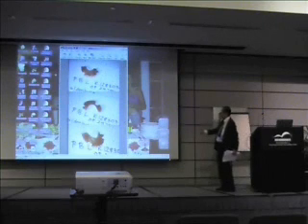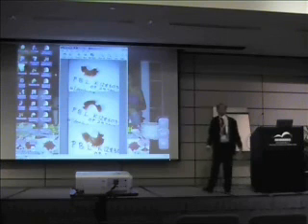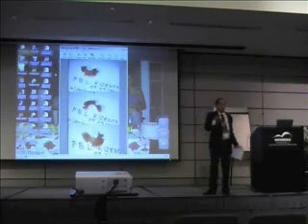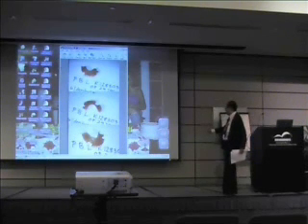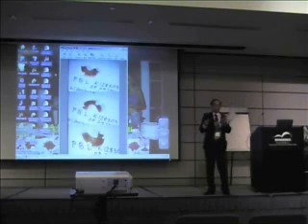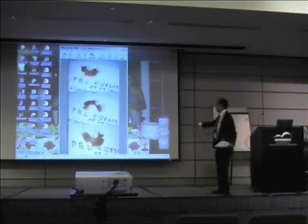Yeah? Now you see what happened is that inside here, which is not very clear, and inside here, do you see something that is added inside here? What I use is a soft liner. The implant has got a hard liner, which you use for denture, and you can use a soft liner. I use a soft liner so that now the implants are sticking in a soft liner. And on the retention area is also soft liner. So underneath this implant is a soft liner.